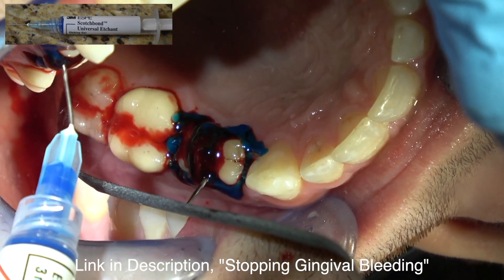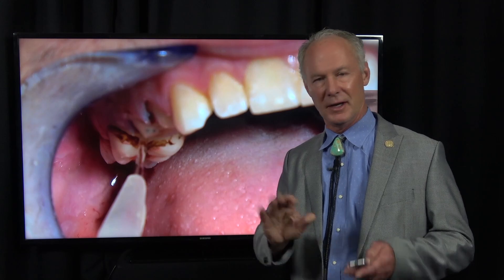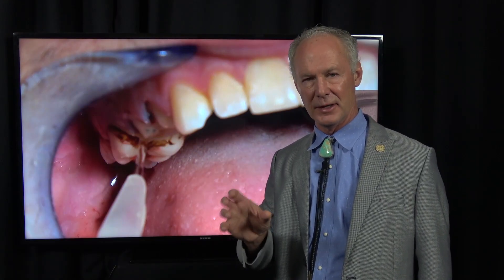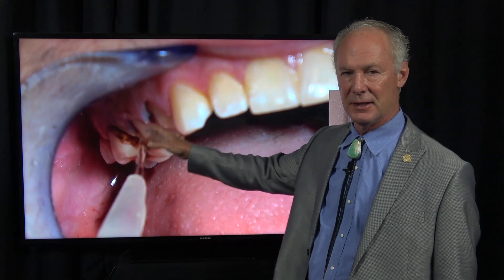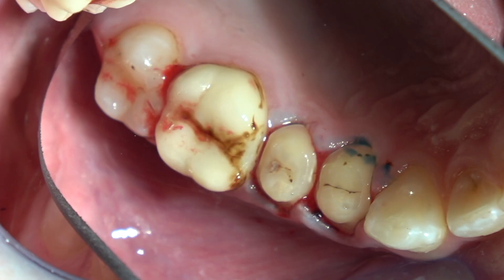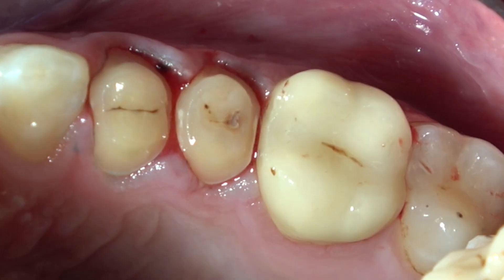You can see there's some blood. Now when you rinse it off, this is very important: if you rinse it with your air-water syringe, you've messed up because that's too much pressure and you're going to cause it to bleed again. Get a water bottle and put ice cold water in it — you want a fairly large tip. If it's ice cold, you probably should have anesthetized the teeth because they'd be sensitive to the cold. Just rinse it off gently. You can see how it scabs and clots. That's how you stop the bleeding.